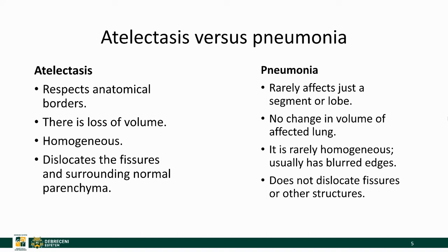We need to differentiate between an atelectasis and a pneumonia. An atelectasis respects anatomical borders like fissures, and there is loss of volume. It will appear homogeneous and will dislocate fissures and surrounding normal parenchyma. A pneumonia, on the other hand, rarely affects just one segment or lobe. We usually won't see any change in volume. A pneumonia is rarely homogeneous — it usually has blurred edges and doesn't dislocate fissures or other normal anatomical structures.